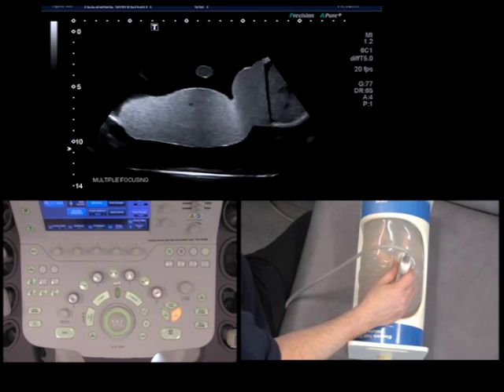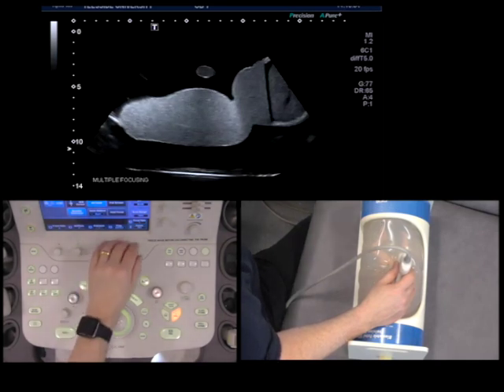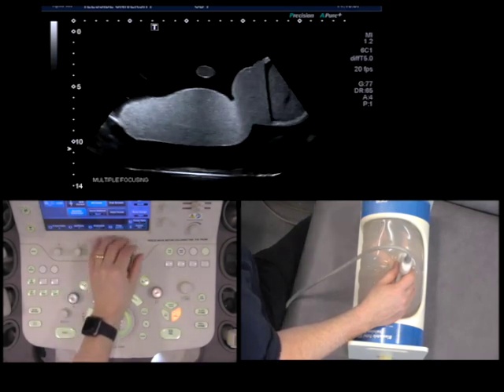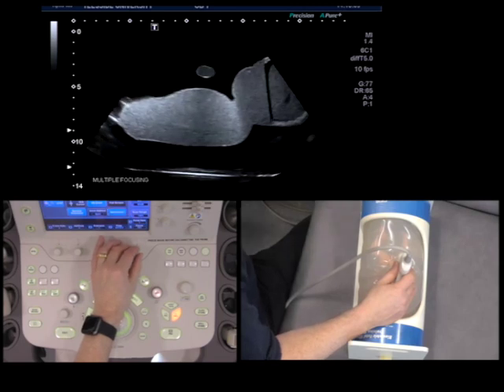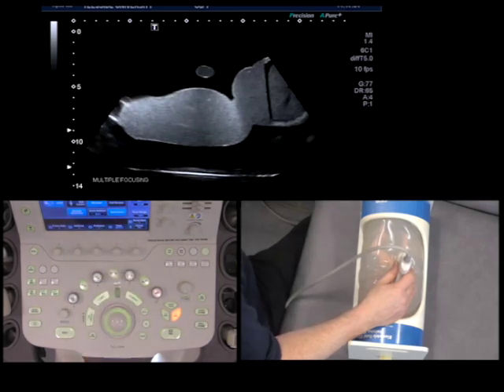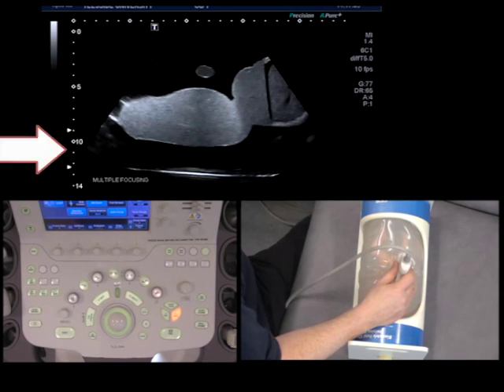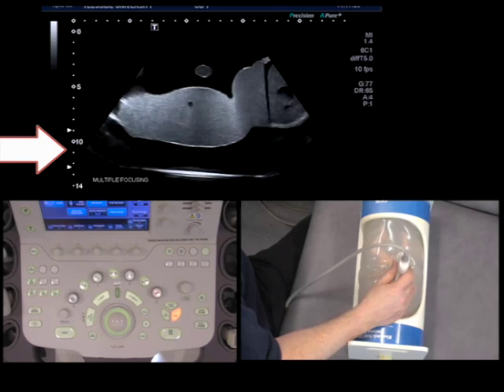What I can do is increase the number of focal zones, which gives us a wider area of good lateral resolution. If I turn this button here, as you can see now on the screen, it is giving me two arrows. What this means is that I will have a higher resolution across a wider area.